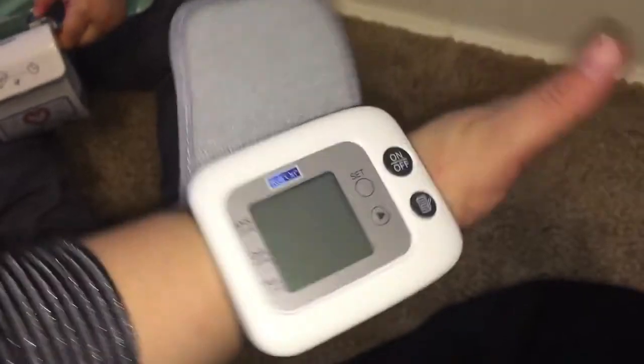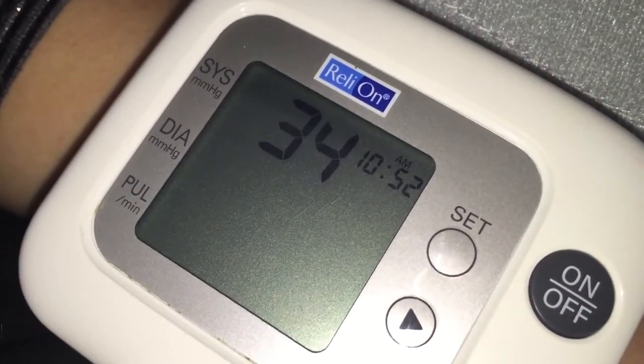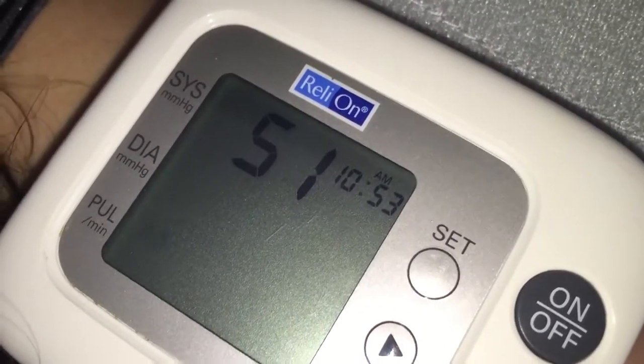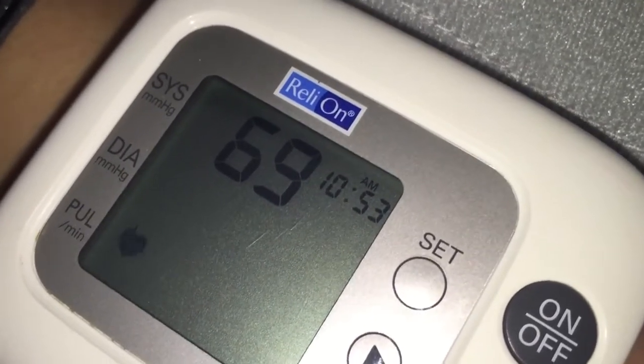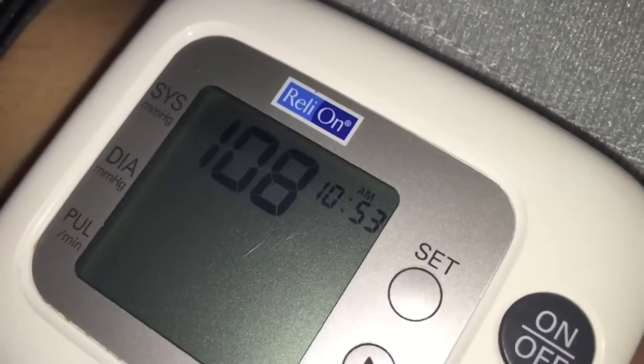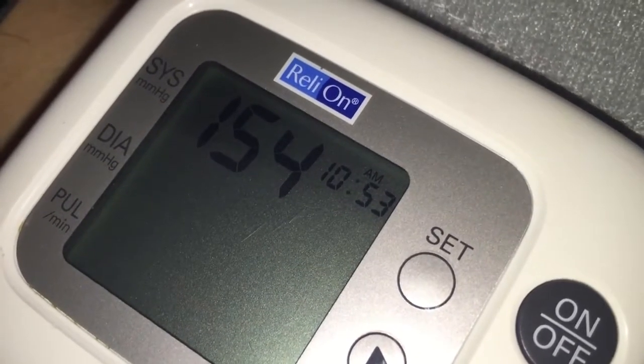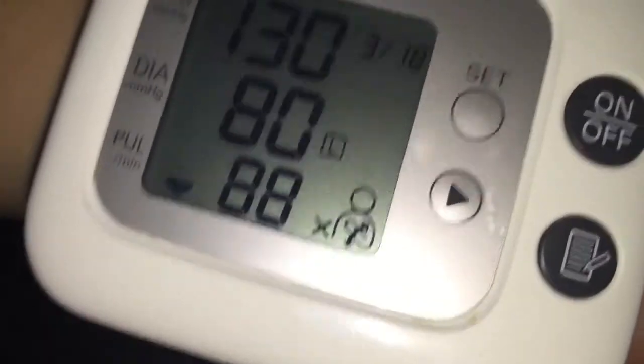Okay, it's on just like it's supposed to be. You put your arm over your heart and then you hit start. The first reading had an error — there's an X in the bottom right corner — so I'm doing it again.